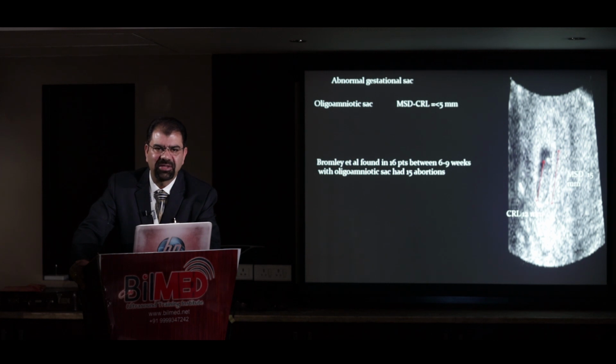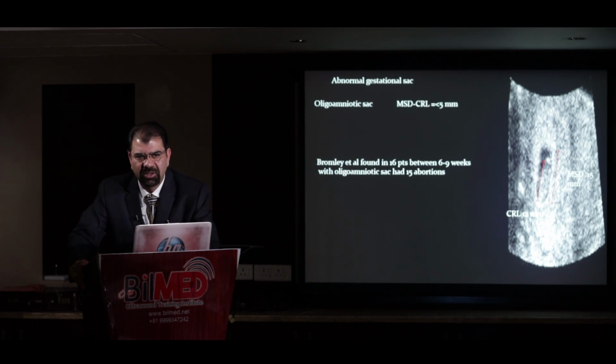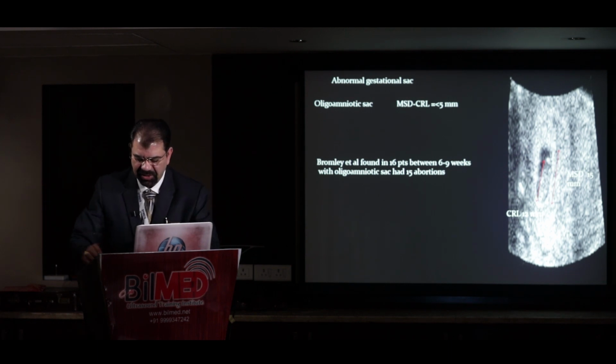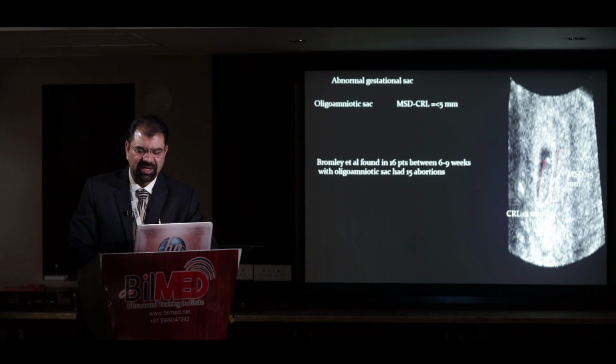the consultant, whoever has sent you the patient, or if you are the same person who is treating the patient, you will get on your toes. Now you will rescan the patient, and you will put everything into action to treat this. How to treat that is not our topic, but now you will label this as an oligoamniotic sac. And remember, 90% of oligoamniotic sacs are lost.